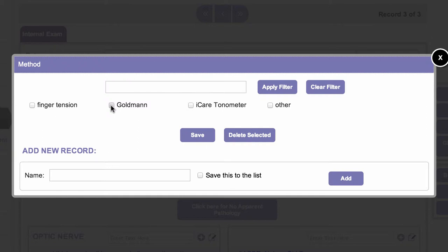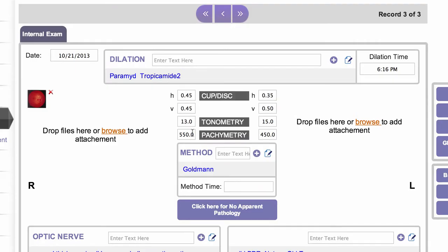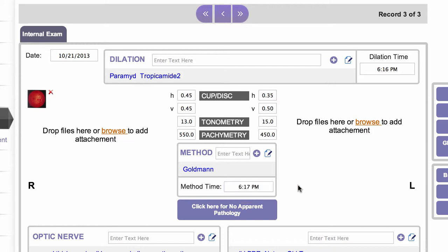Whether you use a Goldmann tonometer, iCare, AirPuff, or whatever you use in the office, you can create a short list there and that will be easy to put in. And then for the time, just double click and it will put the time in.